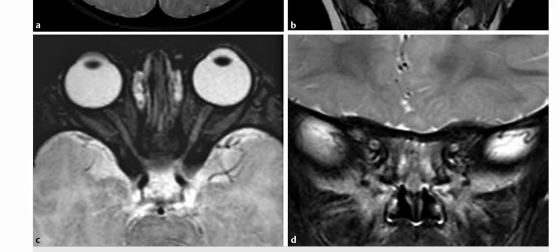So this is a typical case of septo-optic dysplasia. These are typical imaging findings, that is absence of septum pellucidum along with hypoplastic optic nerves, seen in septo-optic dysplasia. And you can also add holoprosencephaly and septal injury in the differentials.